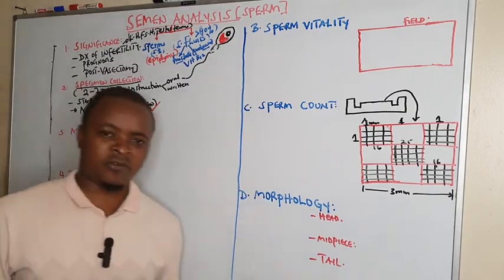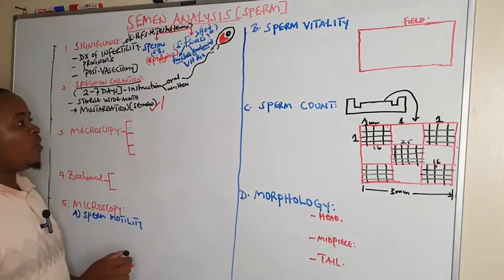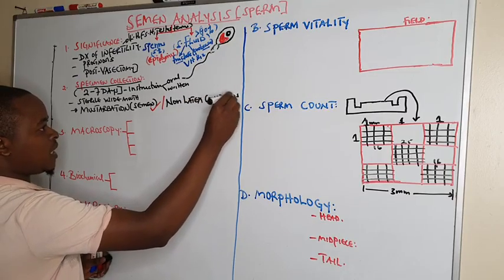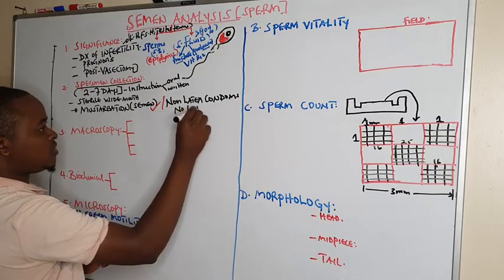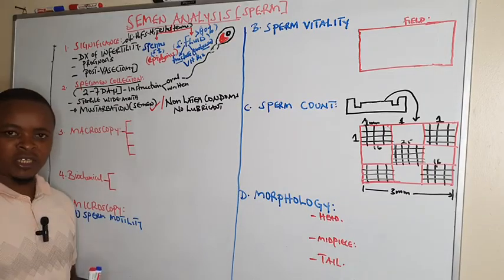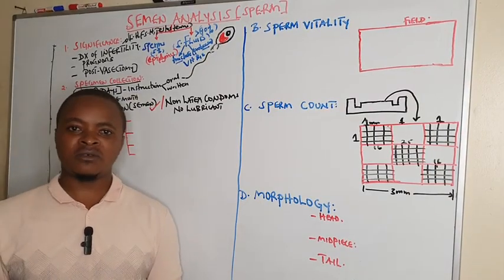But due to religious beliefs, for males who cannot accept masturbation or cannot manage, you can provide another method whereby they use non-latex condoms. These are commercially prepared and free from lubricants, which can be toxic to the sperm. So in case the patient is not able to masturbate, you can give a non-latex condom and instruct the male to put it on before sexual intercourse.